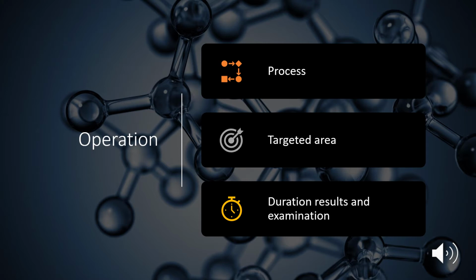The CT scan device is combined of two parts, a bed and the rotation area, where the bed moves forward and the body is scanned all over.